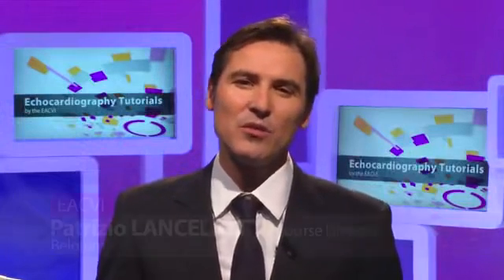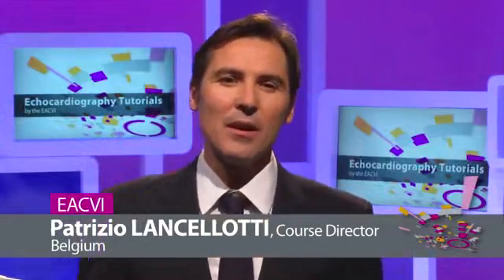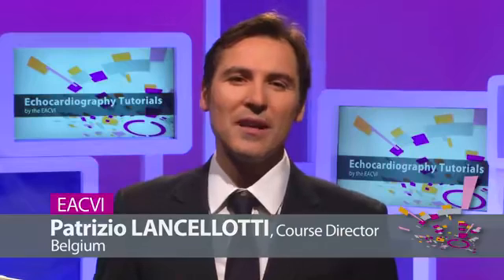Echocardiography plays a central role in the evaluation of patients with known or suspected coronary artery disease. And Luc Pierrard will present how to perform exercise echocardiography in a patient with silent myocardial infarction. He will show the presence of inducible ischemia related to significant coronary artery disease.